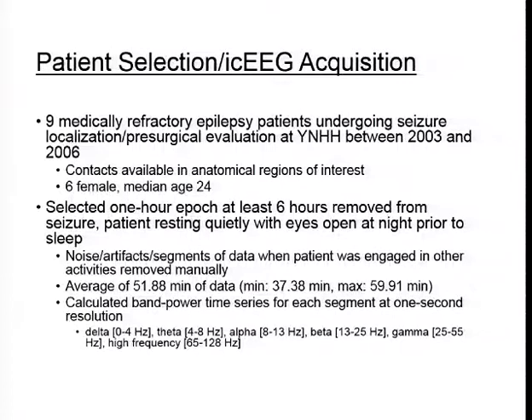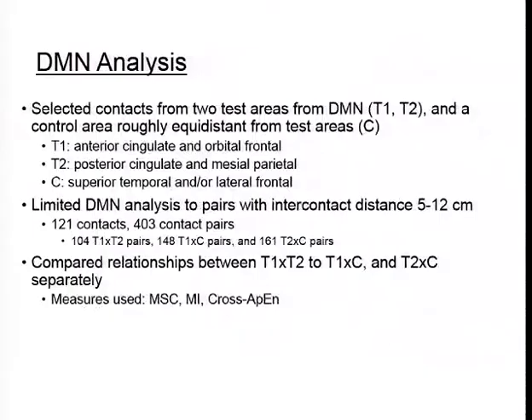For each hour-long segment we calculated band power time series at a one-second resolution in the following frequency bands: delta 0–4 Hz, theta 4–8 Hz, alpha 8–13 Hz, beta 13–25 Hz, gamma 25–55 Hz, and higher frequencies between 65 and 128 Hz.